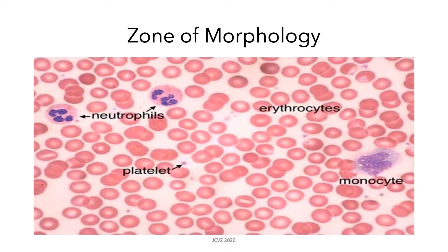Here you can see an example of what the zone of morphology looks like. You can see that there are different types of white blood cells, and most importantly, there is minimal overlapping of the red blood cells. A proper blood smear should have red blood cells that are pink to salmon in color and the nuclei of our WBCs should be violet.